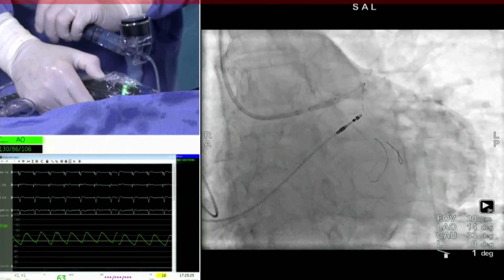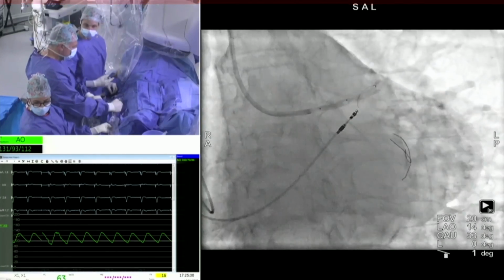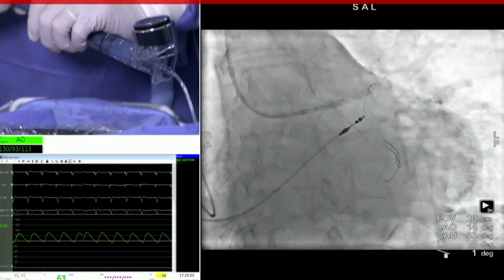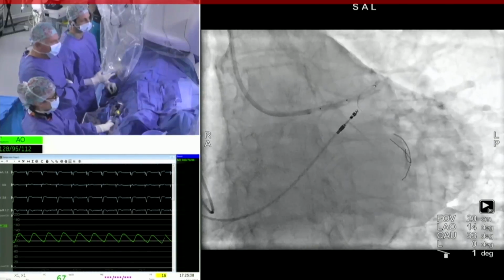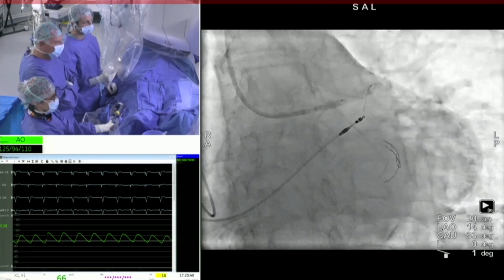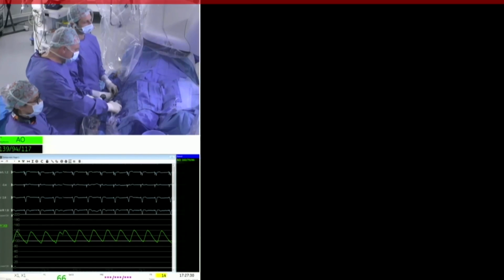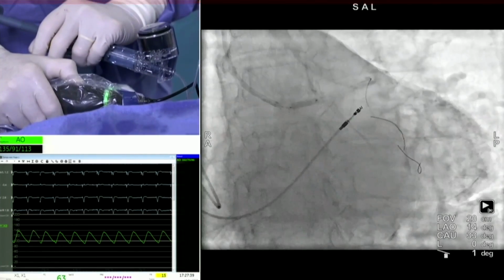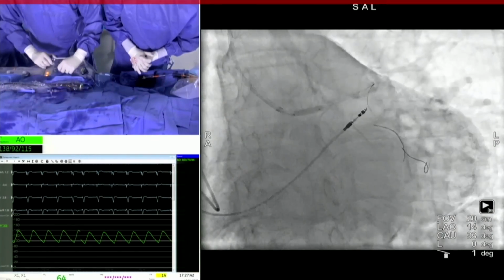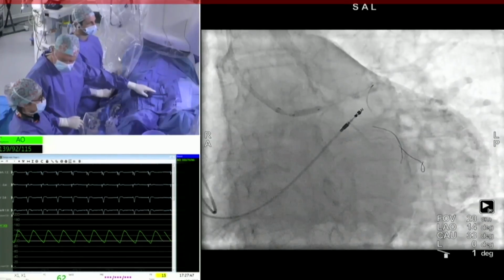Another great advantage of the shockwave in this situation is the ability to keep a guide wire in the side branch, which is of course not possible with a debulking therapy. So we can protect the circumflex despite treating the left main to the LAD. So we go to the proximal part of the left main, still at 4 atmospheres, then we deliver the therapy, with perfect hemodynamic tolerance of the angioplasty and no ectopics, no premature ventricular beats induced by the IVL application.